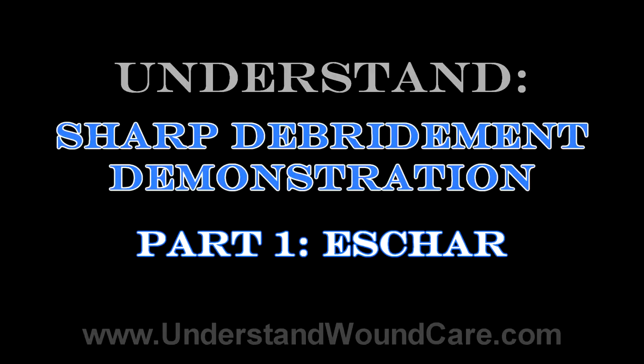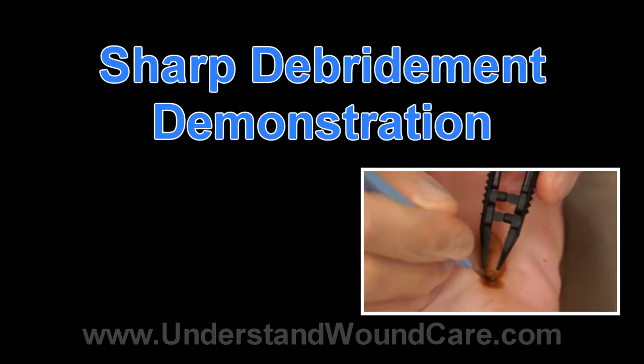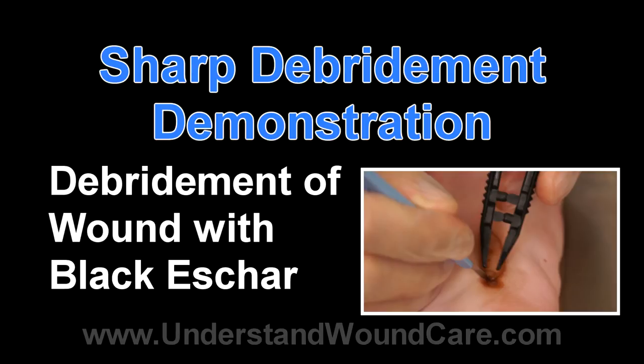This demonstration will show the correct procedure for performing debridement of a black eschar such as commonly found on a sacral pressure ulcer or a pressure ulcer of a lower extremity site.